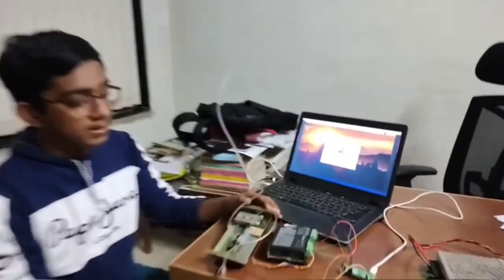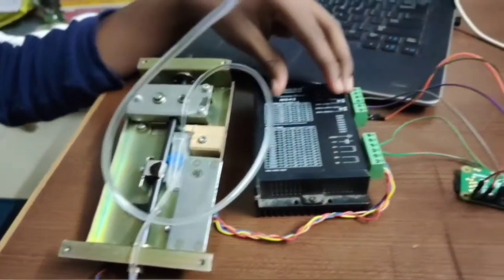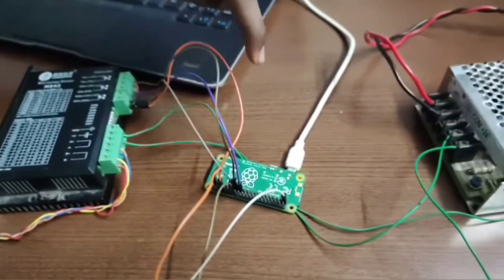Let's start the demo. This is our infusion setup. This is the hardware stepper motor. Our roller clamp is fixed here. This is the stepper motor driver, Raspberry Pi controller, and then the power supply. This is our software demo, code developed in Python.